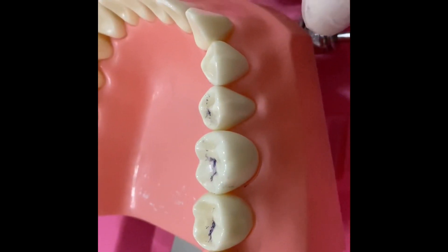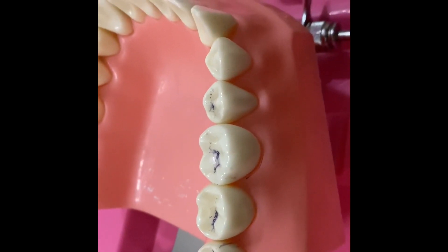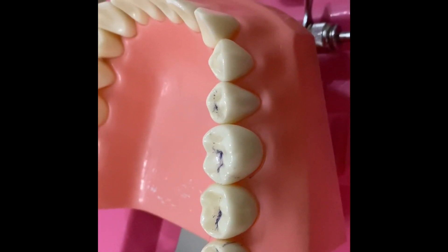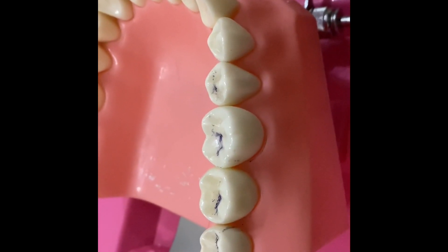In the lower jaw, we can use either infiltration or the ID block, depending on the situation.